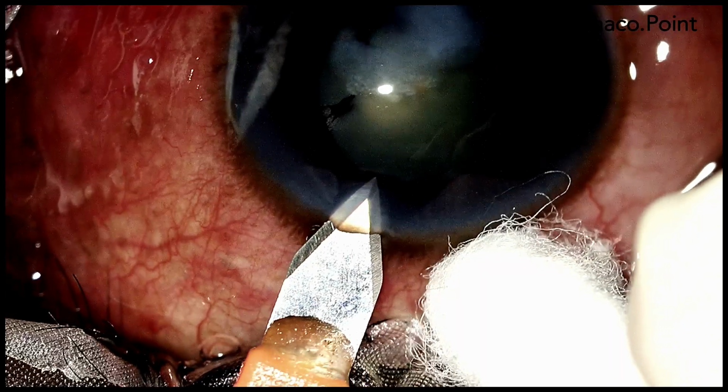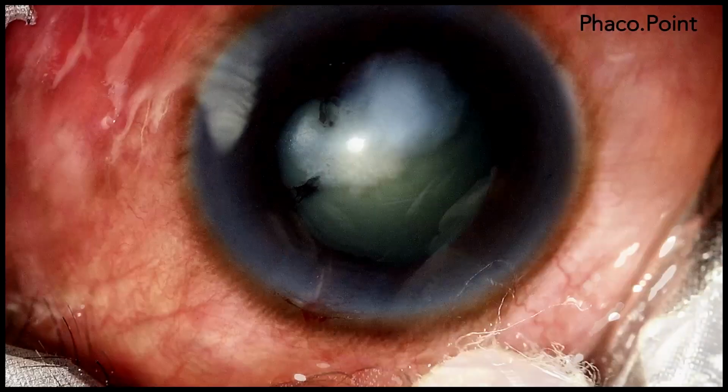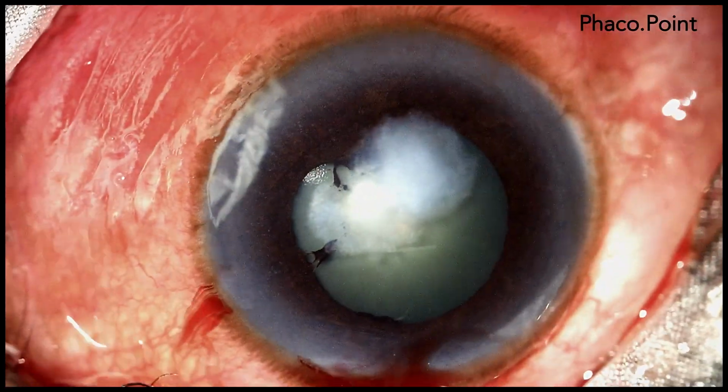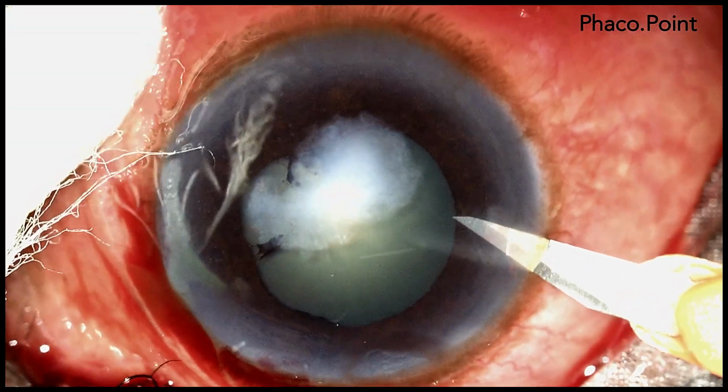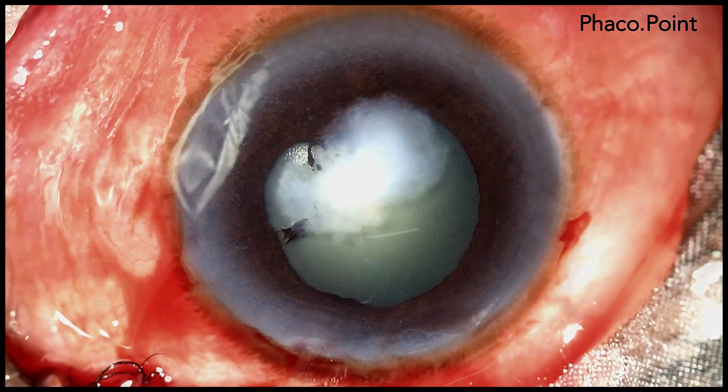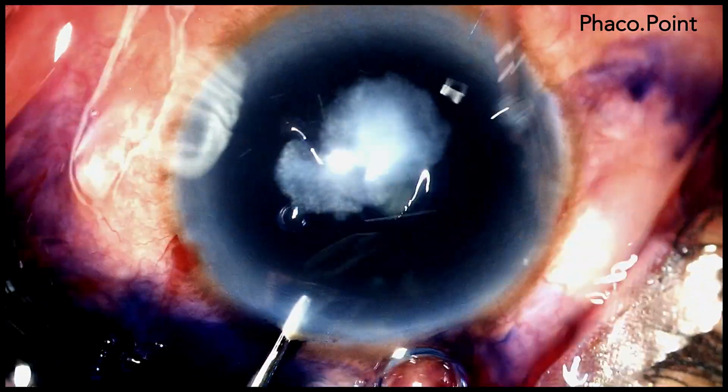While making the incisions, we need to remember that sometimes, depending on the position of the opacity, we might need to change the position of our main incision and therefore also the paracentesis incisions. This might be required to take advantage of the clear area of the cornea while performing the nucleus disassembly and emulsification. The next step is the staining of the anterior capsule with blue dye.